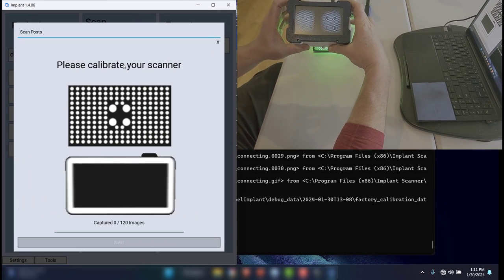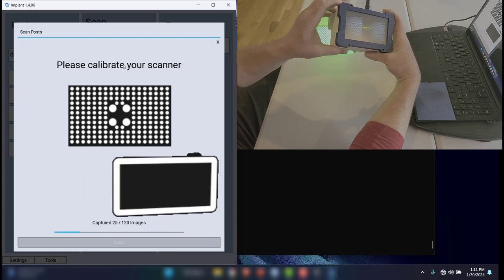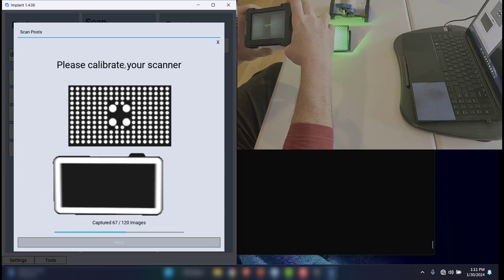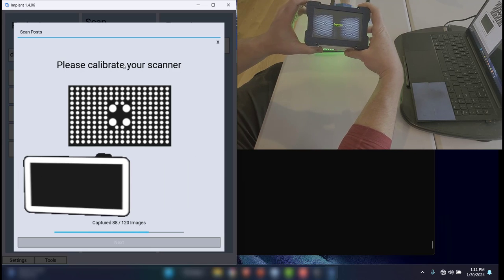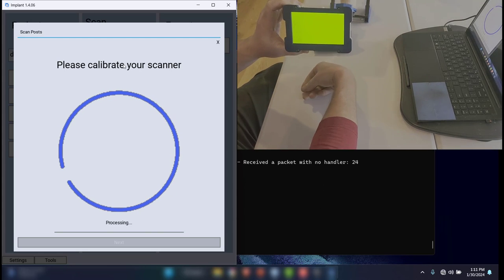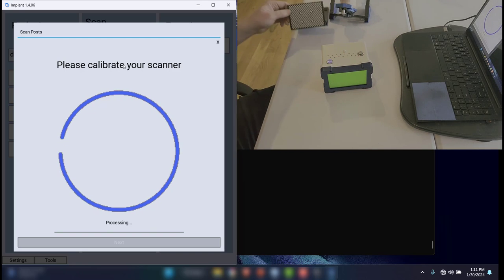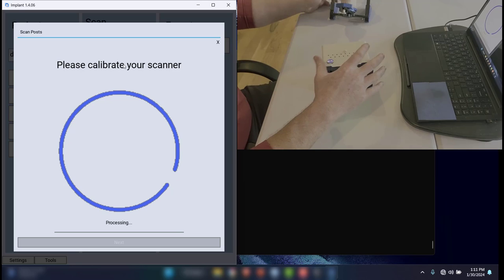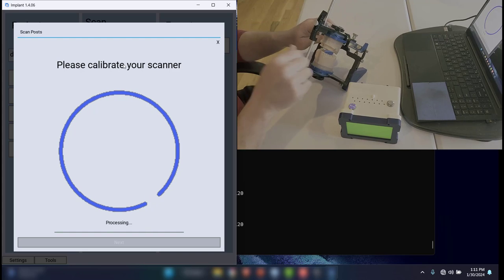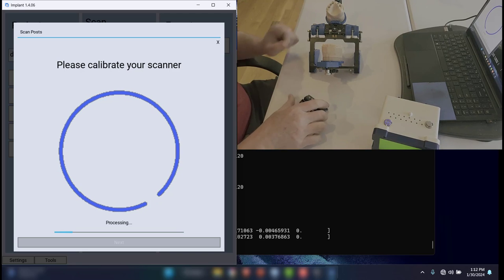All right, so I'm going to get to the right distance, and I'm just going to start capturing data. And so I want to go horizontally, almost perpendicular to the scan calibration plate. And it's almost done, as you can see there. And now it's finished the calibration process. You'll see on the software it will turn to where it says you're ready to capture once it does the calibration processing.